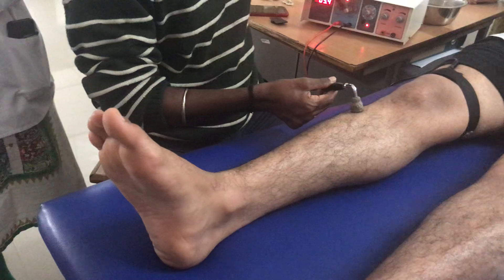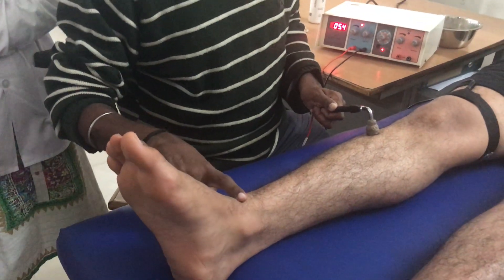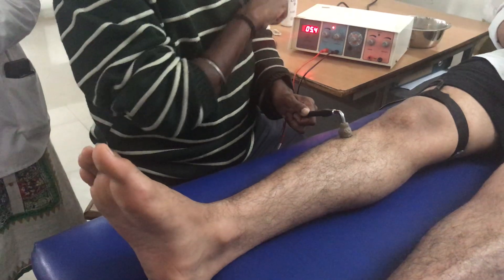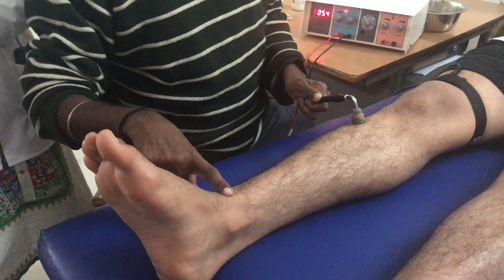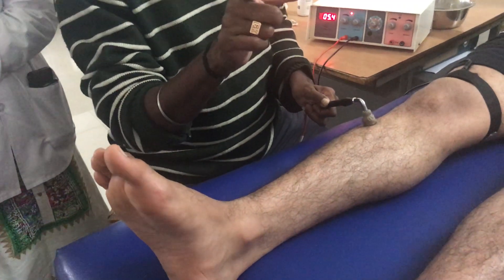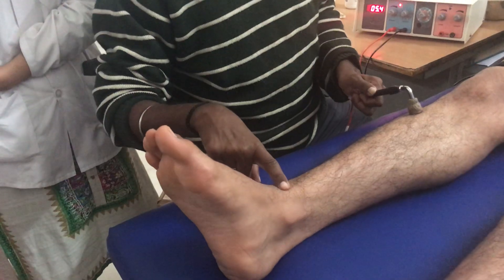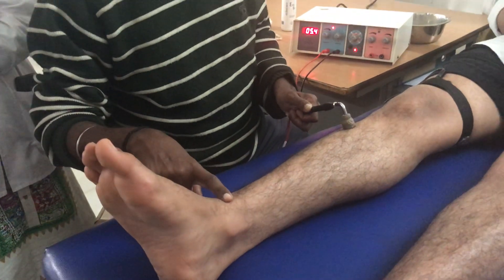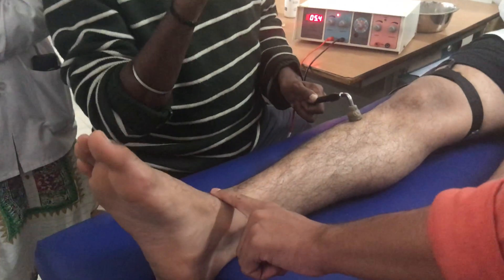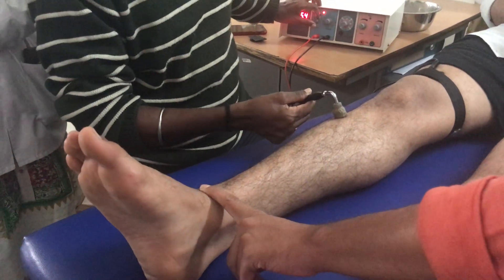Now going to the next lesser duration, 0.3ms. After coming down to at least 1ms I was getting a contraction of lesser strength. Now I have come to 0.3ms — without changing anything in my intensity it stopped responding completely. This confirms what I said in the theory lecture: anything less than 1ms requires a definite increase in intensity. Even though this is a normal muscle, when I come to 0.3ms there is no contraction at all.